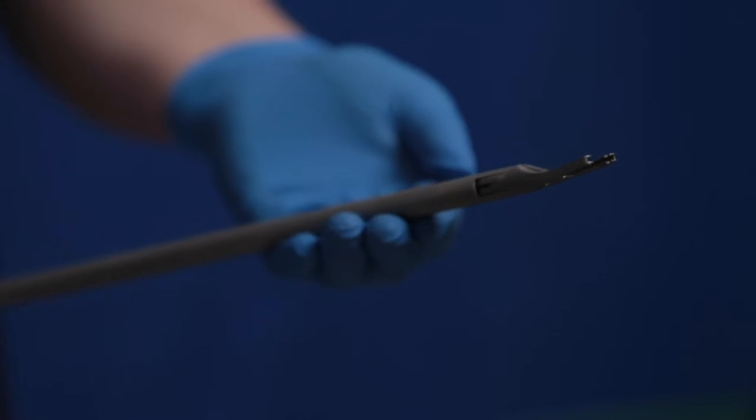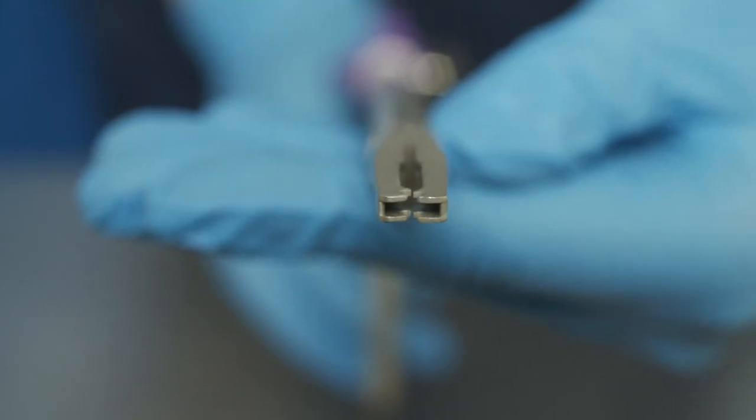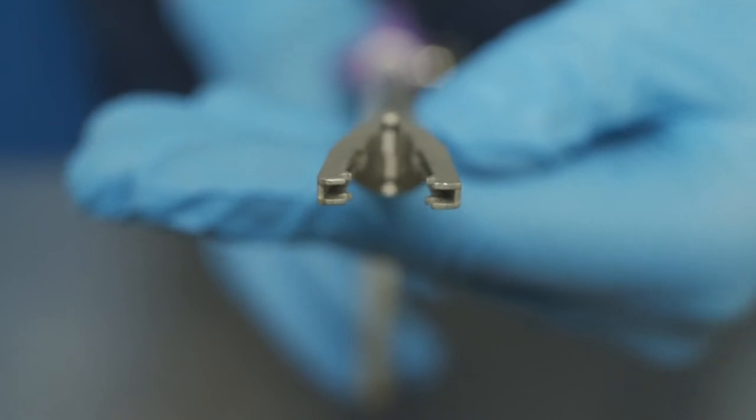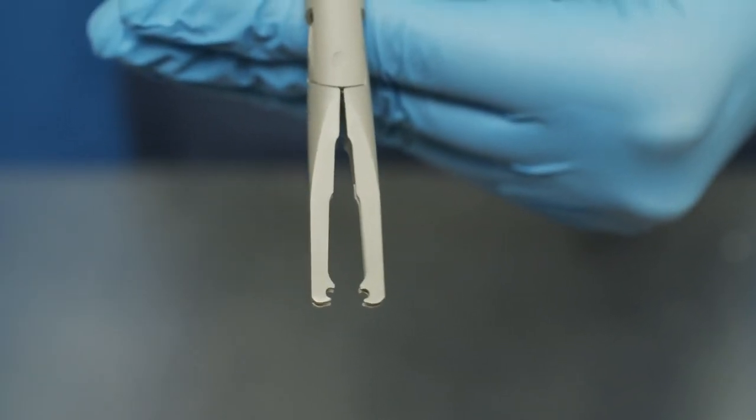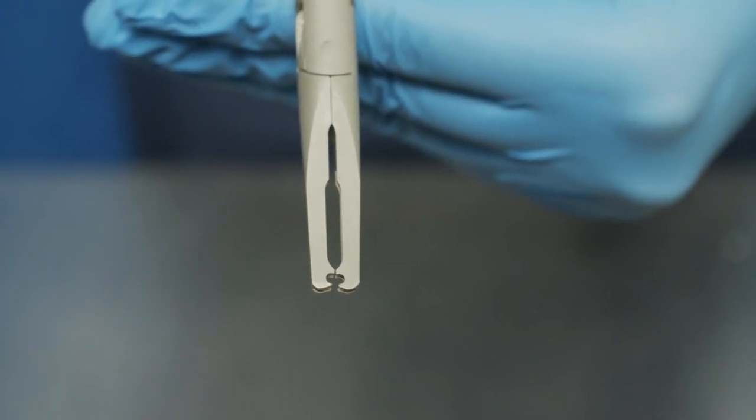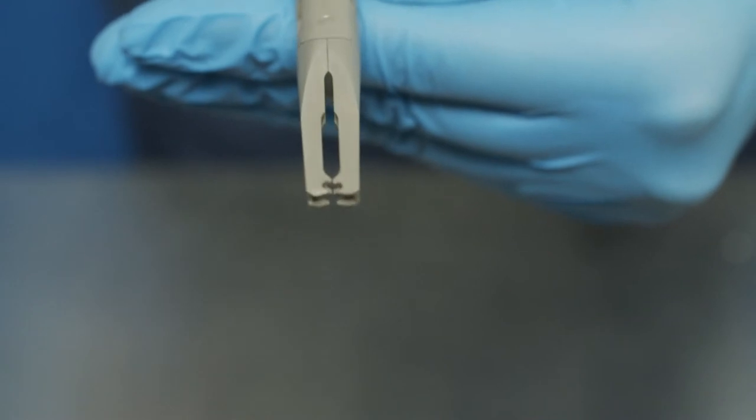Now, check the applier jaws. To do this, turn the applier so that the jaws are facing you. As you open and close the applier, make sure the jaws are directly aligned when closed. It is critical to ensure the jaws are not closing offset to prevent incorrect application of the clip and potential patient injury.